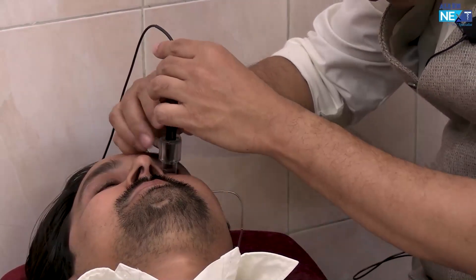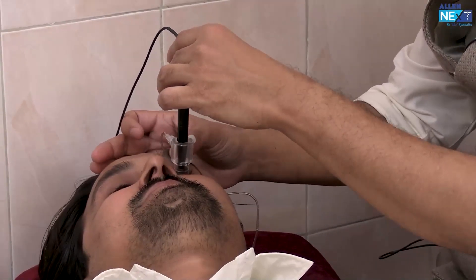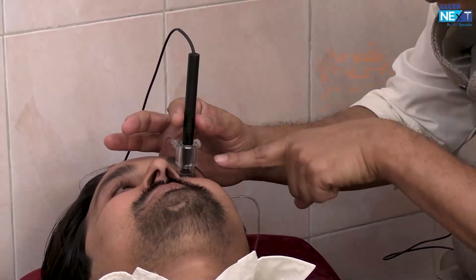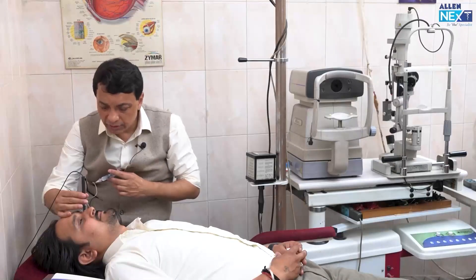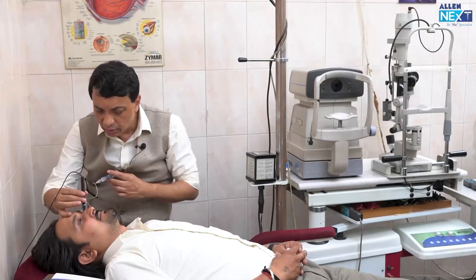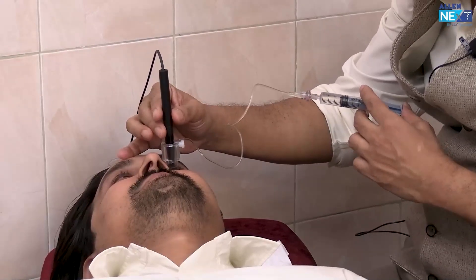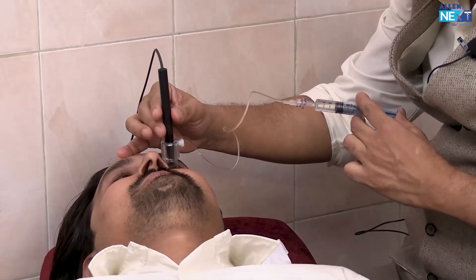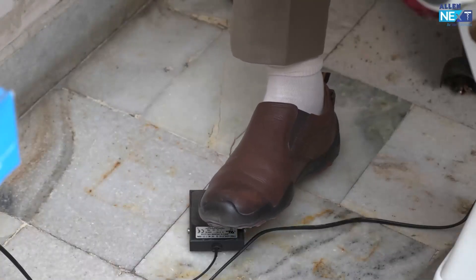Now instruct the patient to look at the light for fixation. Position with your right hand — let's turn this forward. Instruct the patient to look at the red light at center. Now here comes the water. The probe is aligned and now to start the reading we first have to press the foot switch.